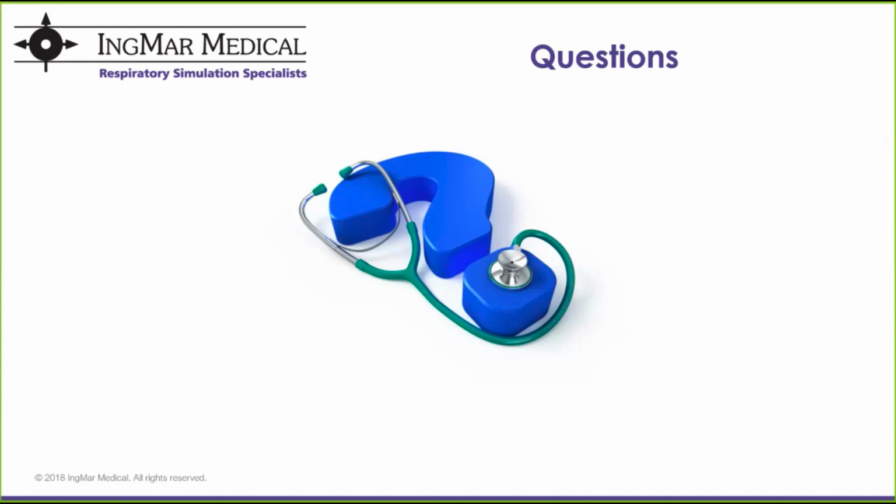We had a question from someone who joined a little late. Josephine asks, does this come with SimMan? This is an option now for the SimMan 3G family. In fact, the lung solution is compatible with 4 different models of the SimMan: the 3G, the 3G trauma, the essential, and the essential bleeding. Any of those mannequins would be able to be integrated with this solution, but it is an additional piece that would need to be discussed with Laerdal.